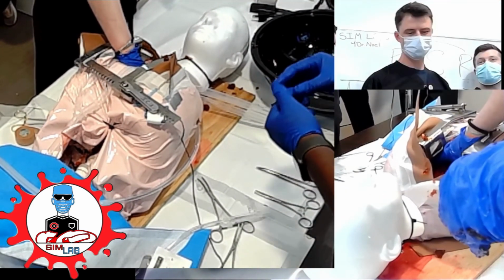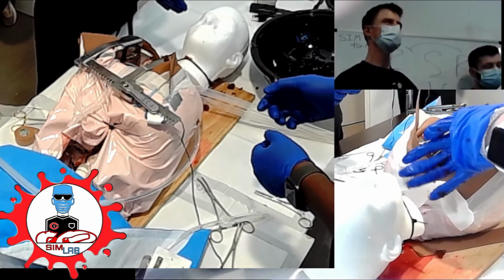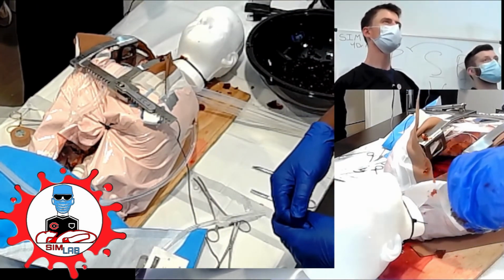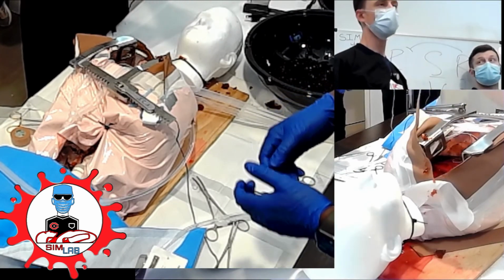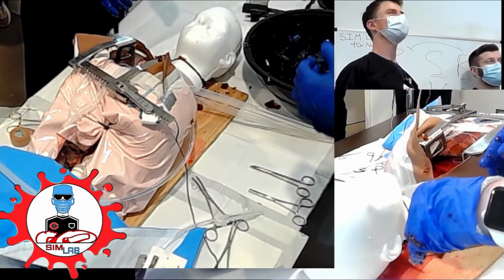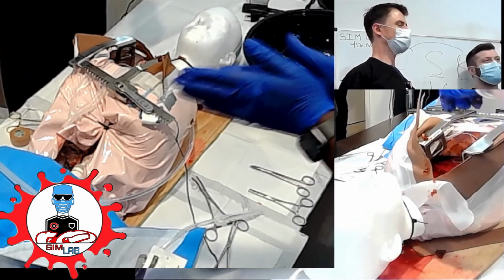Alright, so now the patient goes into VFib. VFib, so we'll shock again, but this time, since it's open chest, we use internal paddles. Internal paddles, yeah. And how much are you going to shock at? 30. So yeah, pretty close, like 20. Okay. And where are they located? In the heart cart. And what is the combination? Cabbage. Yeah.